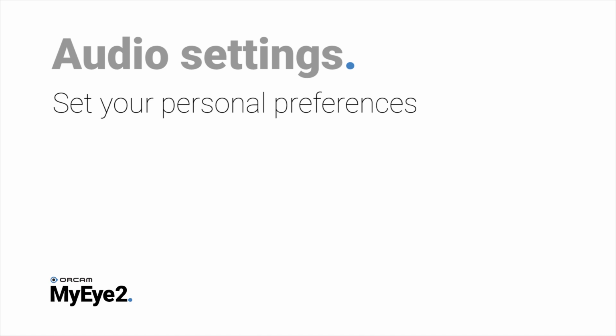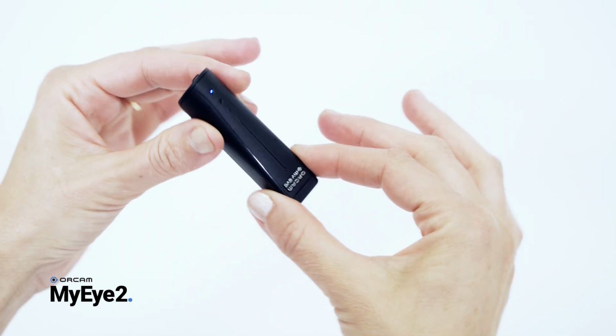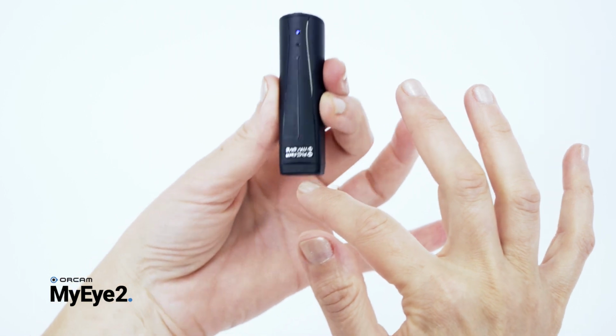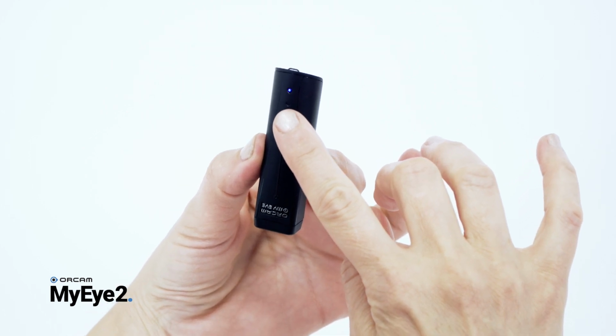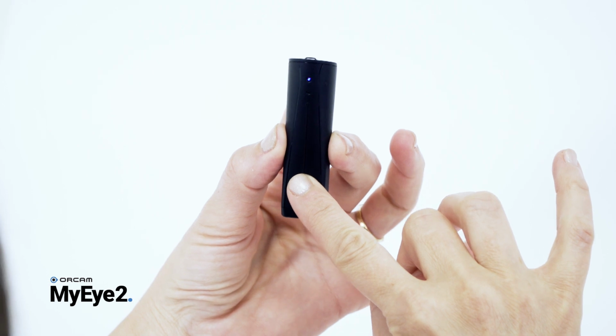In the audio settings menu, you can tailor the device to fit your personal preferences, including the speed of reading, the voice, and much more. To enter the audio settings menu, hold the narrow sides of your device with the touch bar facing you and the camera facing down. Simultaneously press and hold the power button with your pointing finger, while with your other pointing finger, swipe the touch bar from top to bottom.